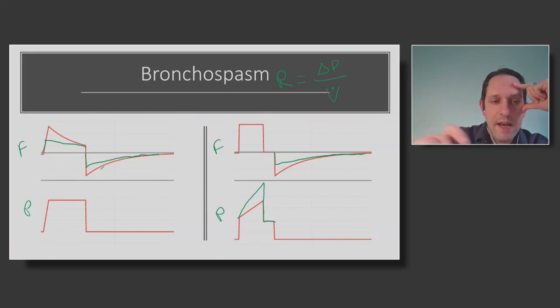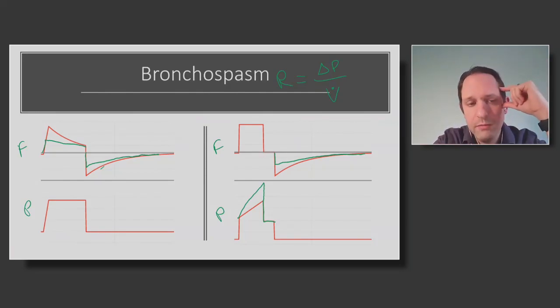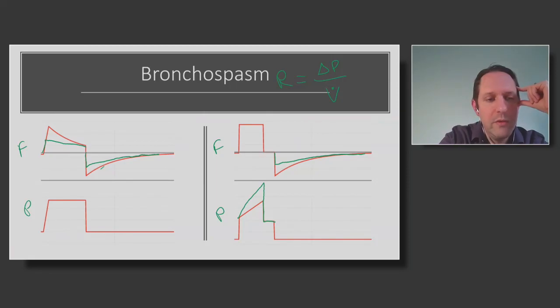Now, the one issue that you may face, particularly in pressure assist control, is that many ventilators auto-scale. When they auto-scale, it will take this waveform here and scale it to be up here. So you will have a similar slope because your time scale is not going to change, but it's not going to look much lower on the screen as it would if you saw it change in real time, because usually it'll auto-scale after a few breaths.